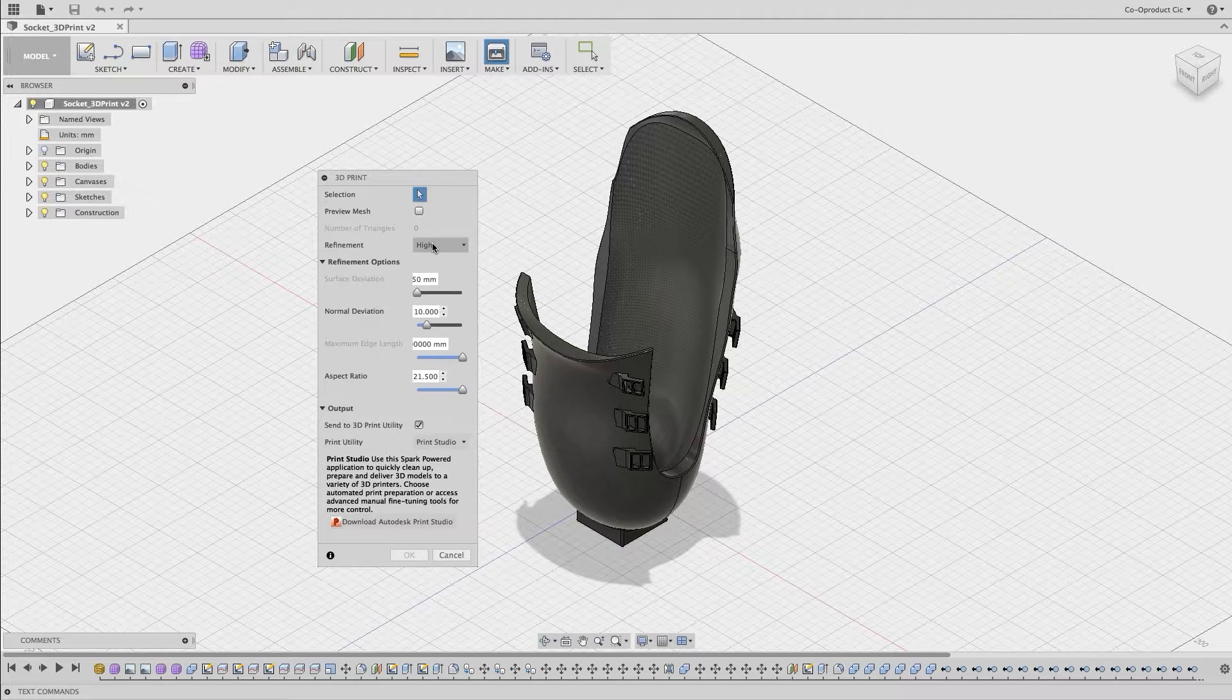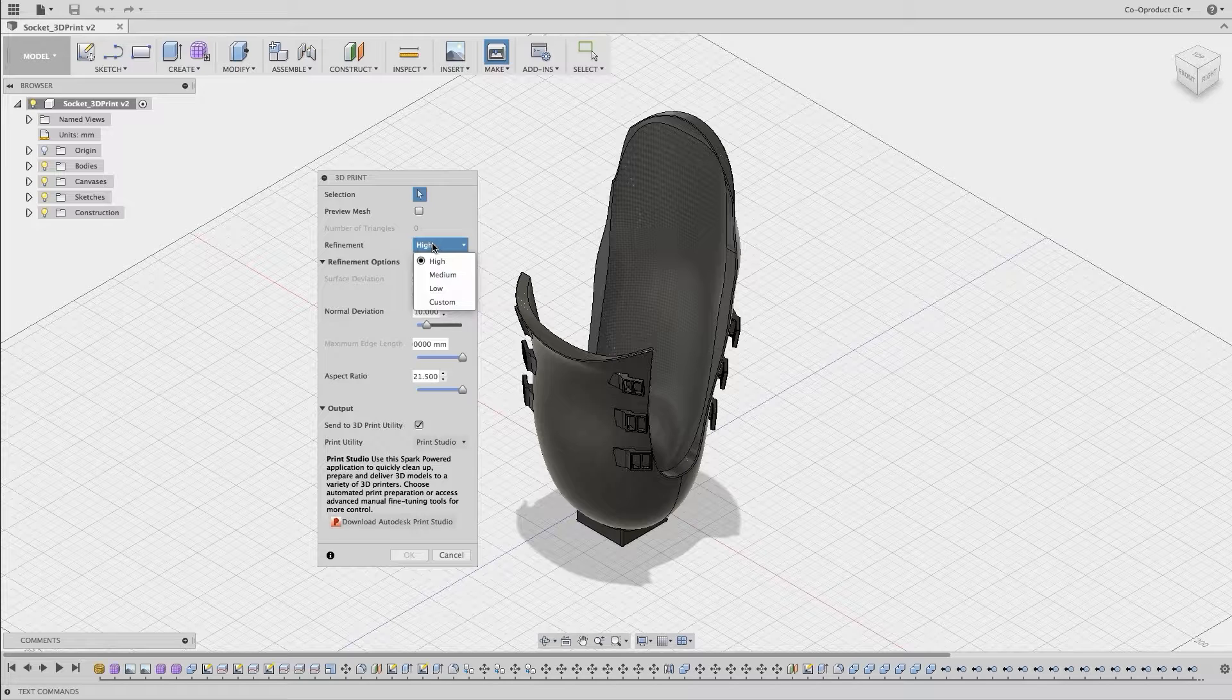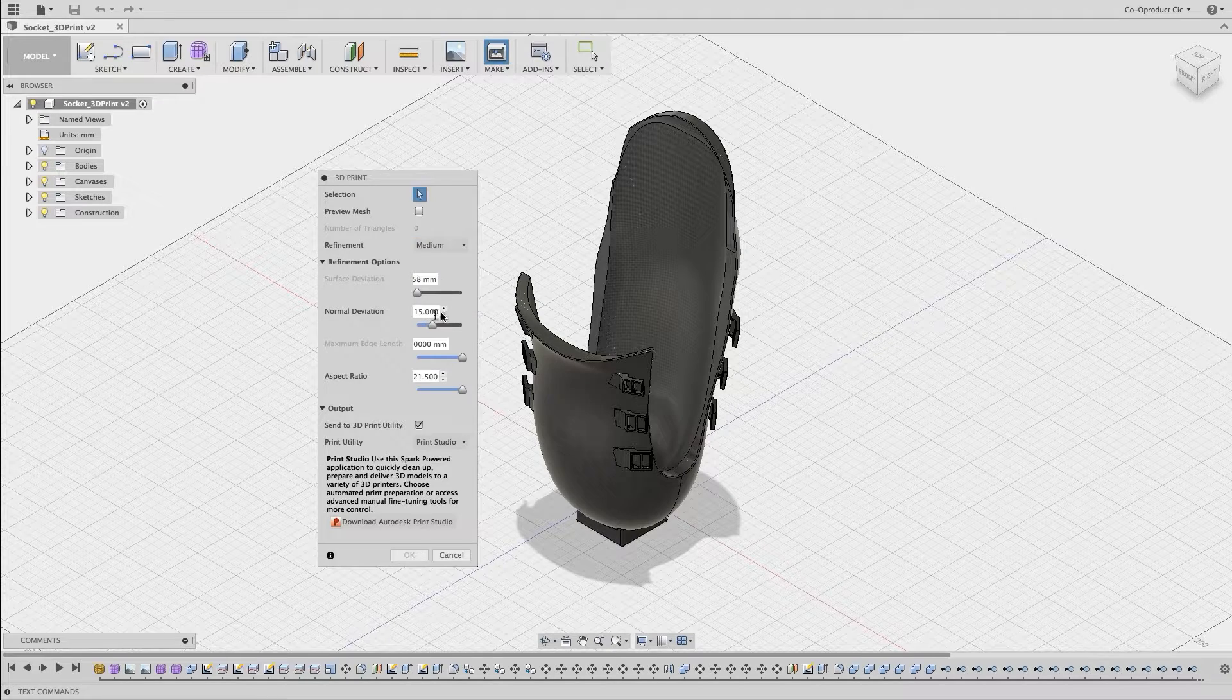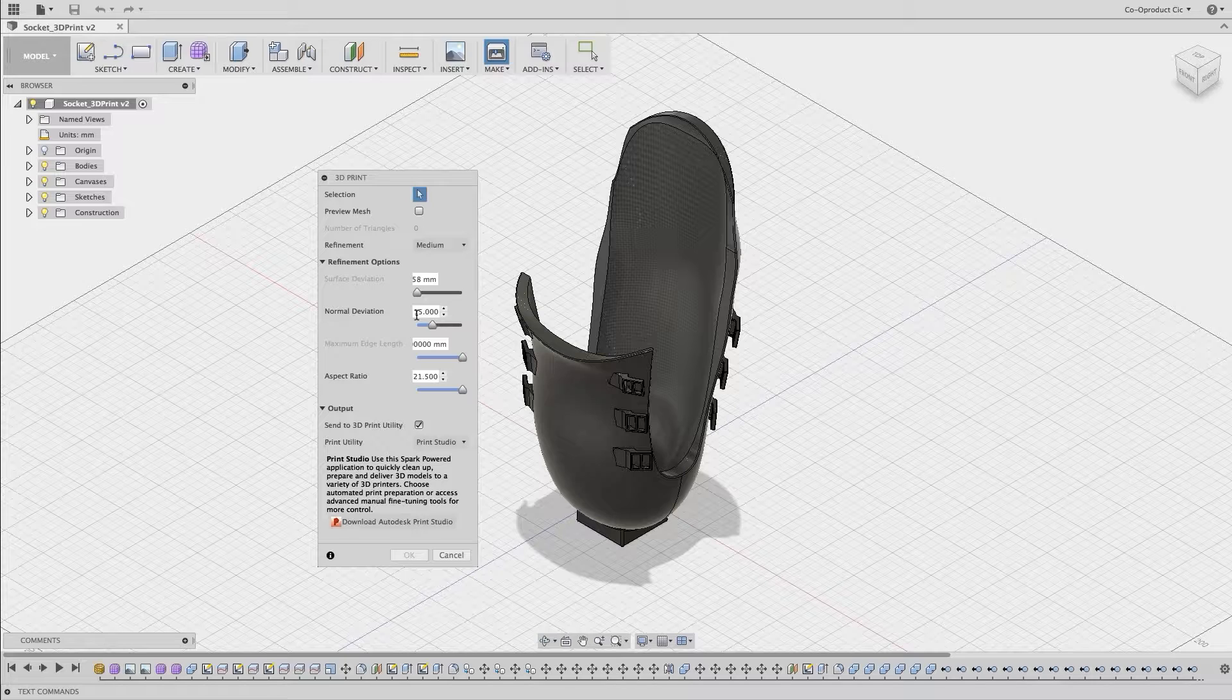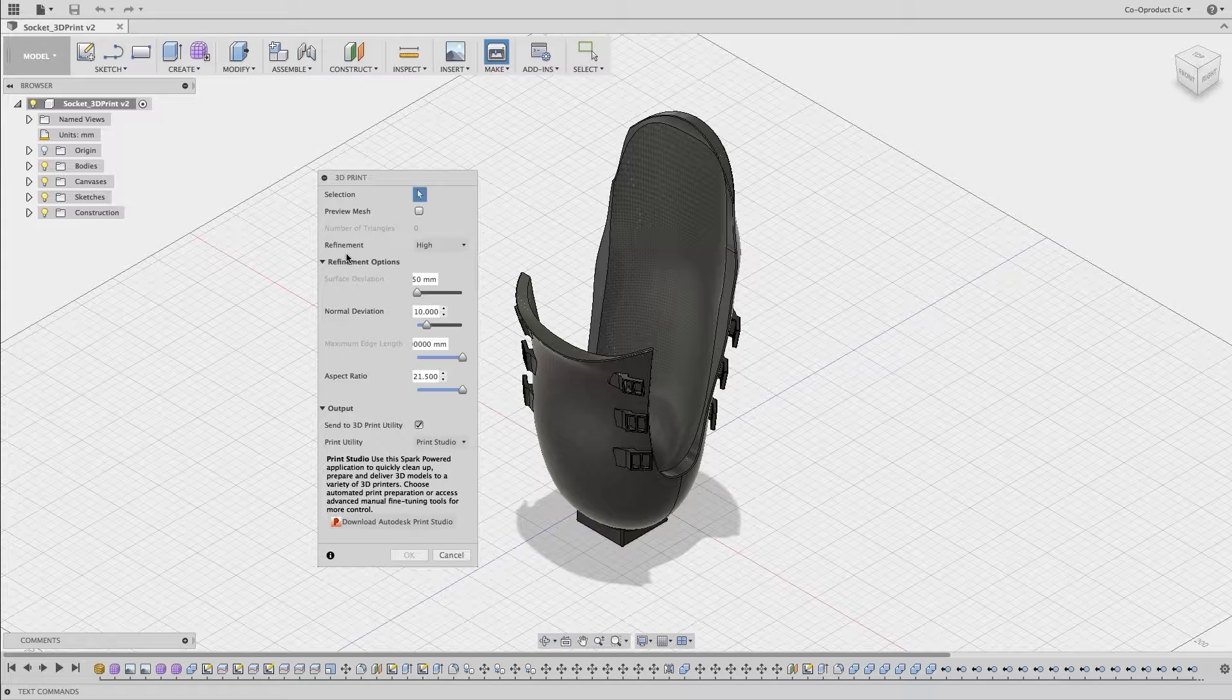If we toggle between the preset refinement options, we can see that it also changes the normal deviation. For example, from high to medium, the deviation changes from 10 to 15, and then from medium to low, the normal deviation changes from 15 to 30. So for the moment, let's choose high for refinement.